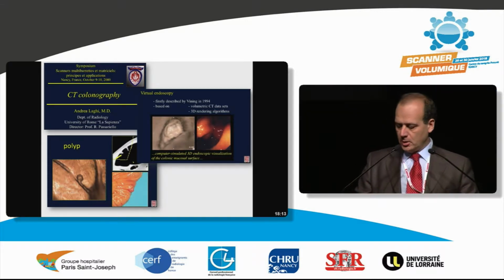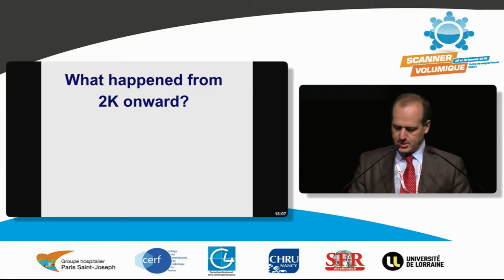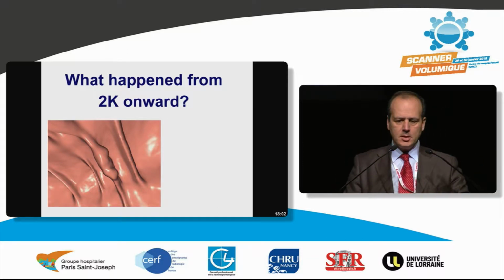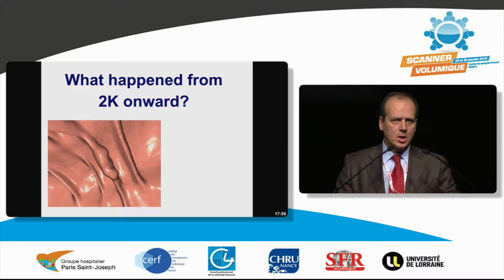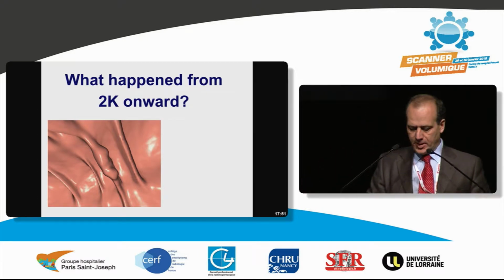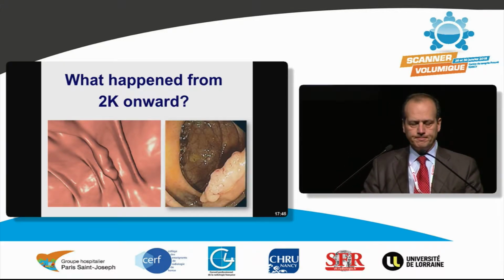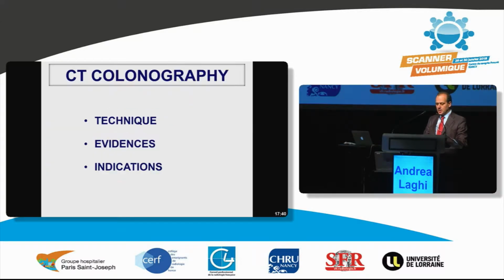So the topic of today's lecture is what happened from 2000 onward, in the last 18 years. Well, I want to show you with a simple image. I showed you before the quality of the images at that time. That's the quality of a CT colonography today, where you see very clearly a flat lesion on a fold, and that's the corresponding optical colonoscopy. Of course, it's not only a matter of image quality, it's a matter of different technique, it's a matter of new evidences, it's a matter also of new indications.